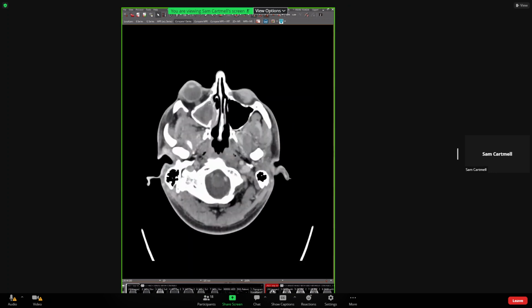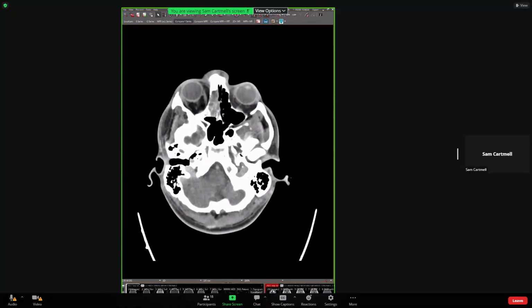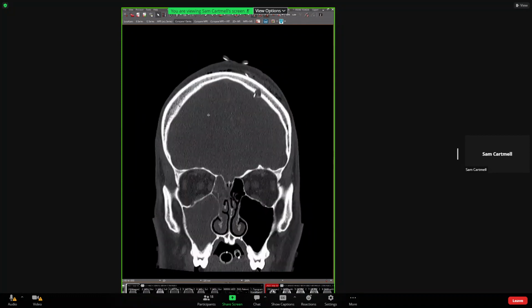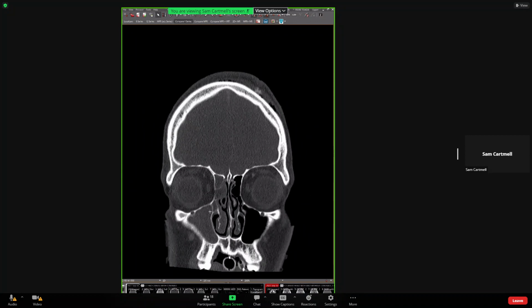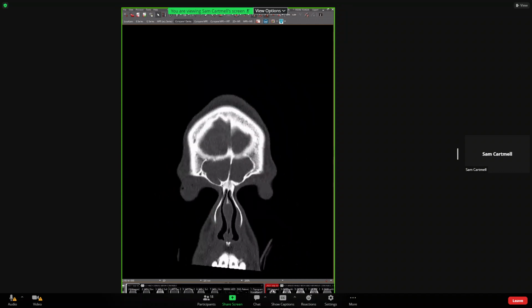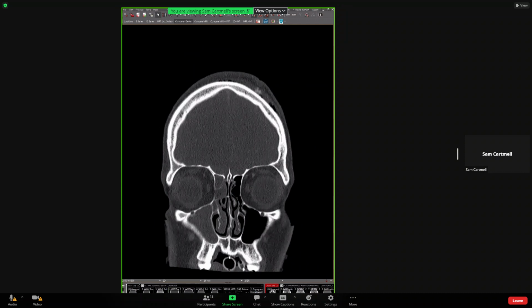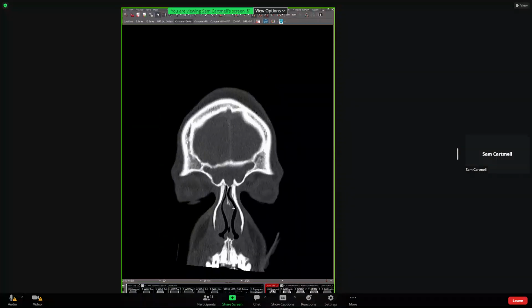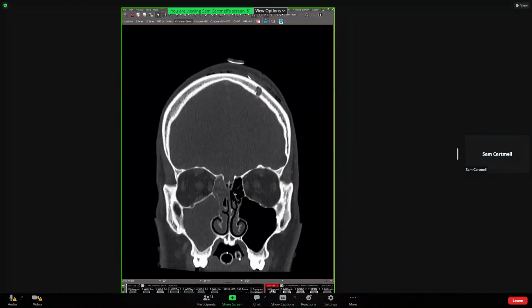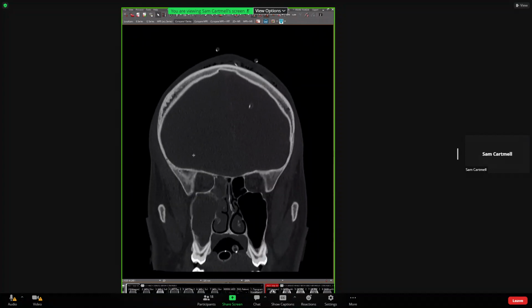There's bulging out of the sinus and into the infundibulum, the osteomeatal complex, this whole right-sided drainage pathway. So just as a brief review, out of the middle meatus drains the maxillary sinus, the right-sided ethmoid air cells, and also the frontal sinus here. So there's clearly an inflammatory process involving that whole right middle drainage pathway. And it's all because he's got bad dental disease. He's 21 at the time.